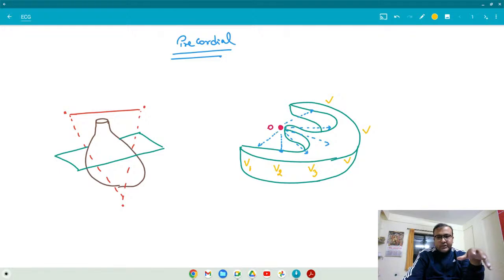Understood? So these are the ways by which we are going to place the 6 chest leads to observe the heart from a horizontal view. So we are now going to observe the heart from the horizontal viewpoint. I think now it is going to be very, very simple for you, because you are going to tell me that if the observer is at V1, what is your opinion?